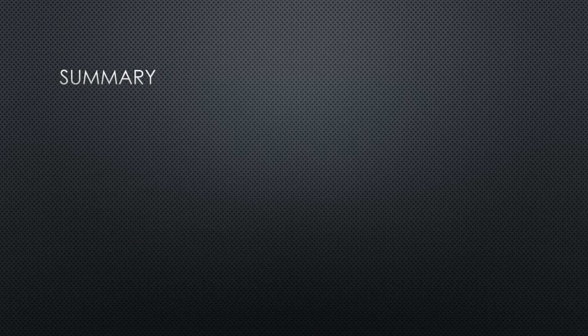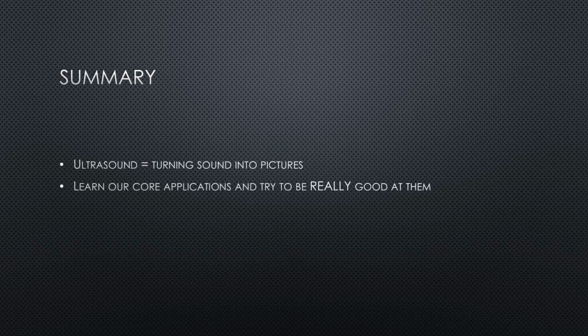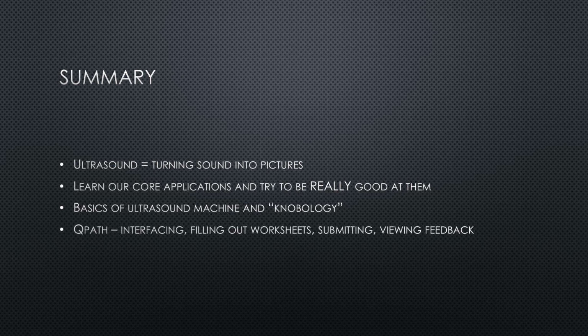So, grand summary, right? Ultrasound is turning sound into pictures. You want to make sure that you learn our core applications and try to be really good at them. We talked about the basics of ultrasound, as well as a little bit more knobology with some of the more advanced stuff. Talked about QPath, what the interface is, how to fill out the worksheets, submit them, and viewing feedback. And now we're ready to scan.